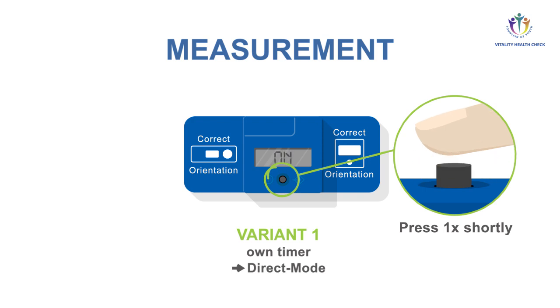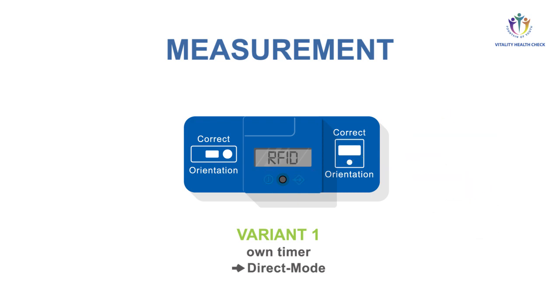After the self-test, the device shows on. To start measurement, press the button shortly, maximum one second. The device shows RFID.